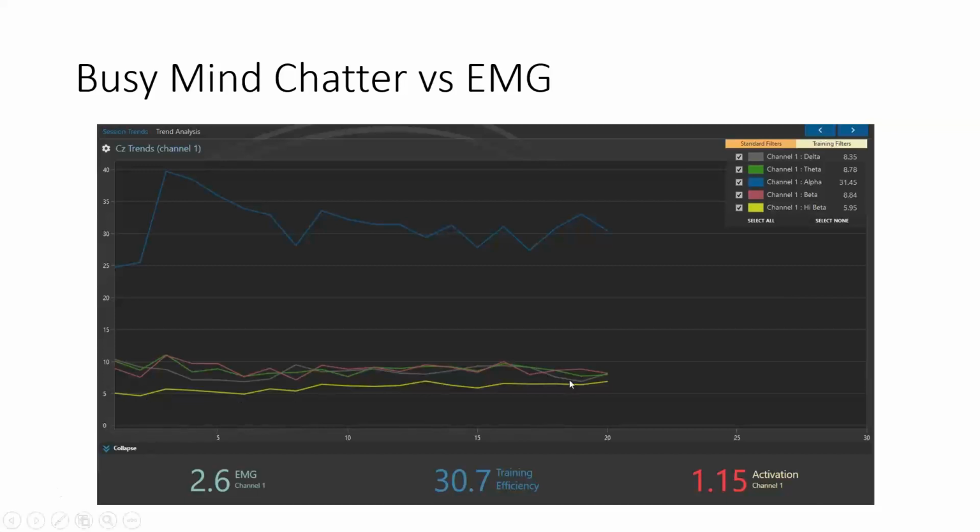And finally, we have busy mind. Notice there's very little EMG. That's because most of the people are keeping themselves calm by keeping a busy mind and suppressing input from the amygdala. This is one of several strategies that show up on your trend screen, different ways people manage their social distress. And if this alpha goes down, eventually you'll start to see this beta coming up. Now we are fairly high. We're at 8, so we know that's not real beta. But notice it's in the 15 to 20 hertz range.